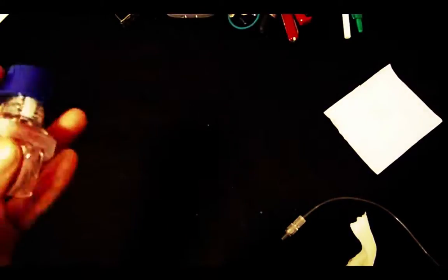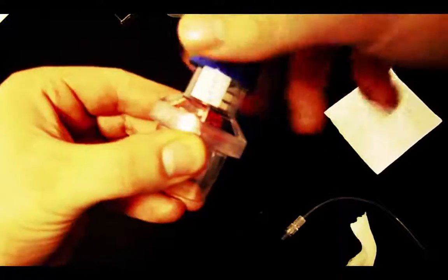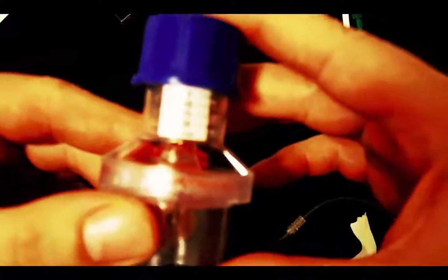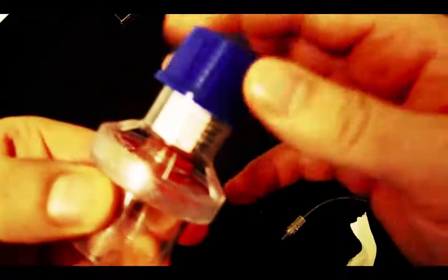The next device is a PEEP valve, which you can obtain from any respiratory therapist in a hospital — just ask for a PEEP valve and most will give you one. This dials from 5 to 20 centimeters of water of PEEP. At the top is 5, all the way cranked down is 20. Here at this setting it's 15, and cranked all the way down it's 20.